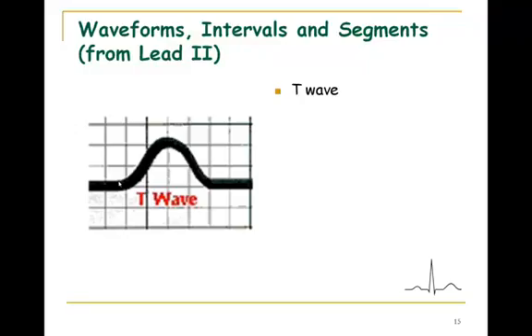It can cause an inverted T wave or what we call a biphasic T wave. Just watch the cursor. It will go up and down and back up, and then you average these two together and they end up being an overall voltage of 0, like I had mentioned earlier in the lecture.